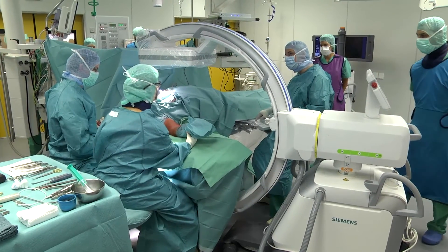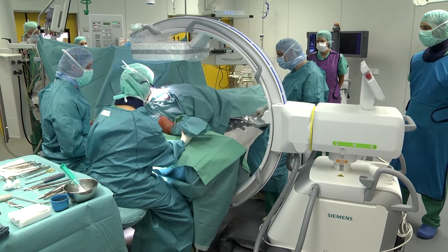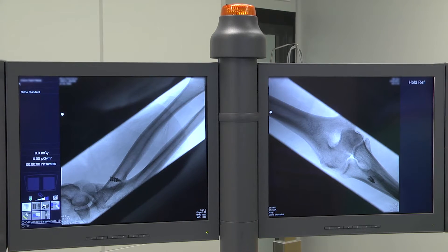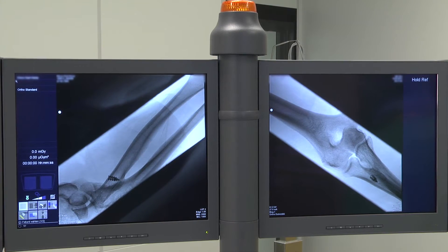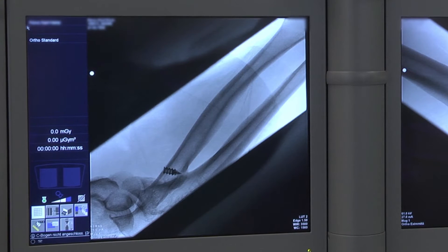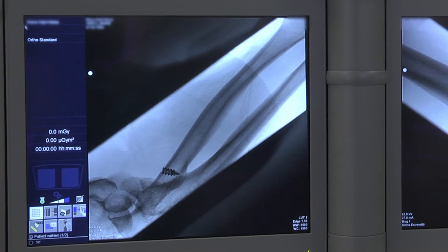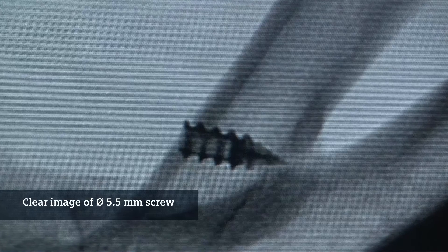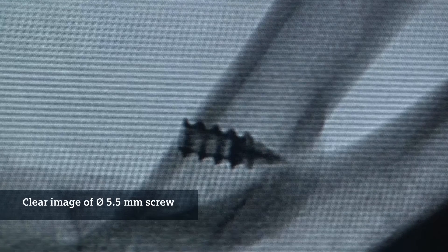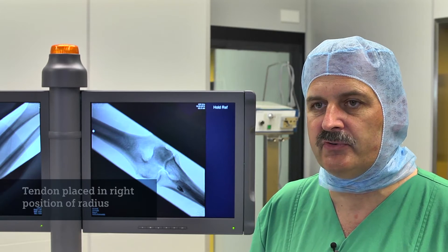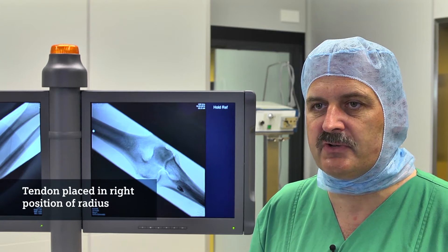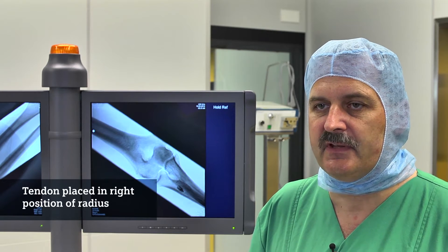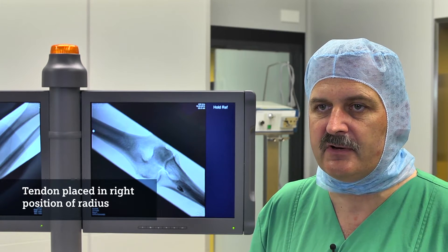During this type of surgery I needed the imaging for positioning of this bone anchor device. As you can see here, this is a very small screw which has a 5.5 mm diameter and we can see it very clearly in these bright images. It was important to see the exact position to be sure that the tendon is placed in the right area of the radius.